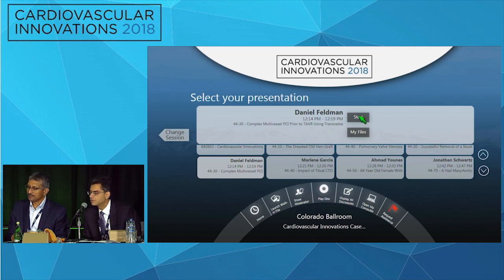And one more thing, many people have said, why don't you start with the simple one, do the right first, do the easy ones, and leave the tougher ones for later and get a little more reserve. Any thoughts? That was one of the points on the slides I didn't really go over. Sometimes going after low-hanging fruit is nice to at least have some territory that's perfused when you go after the more complex disease. We just felt at that time that the left side was the more important side to go after first, so that's the order we went with.